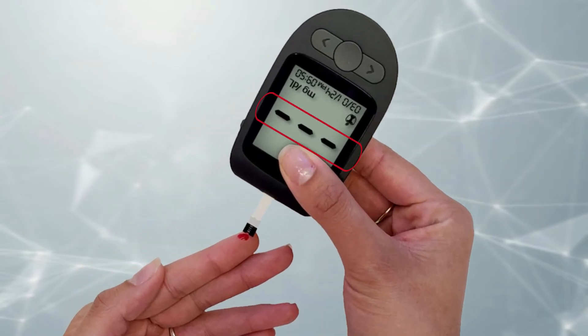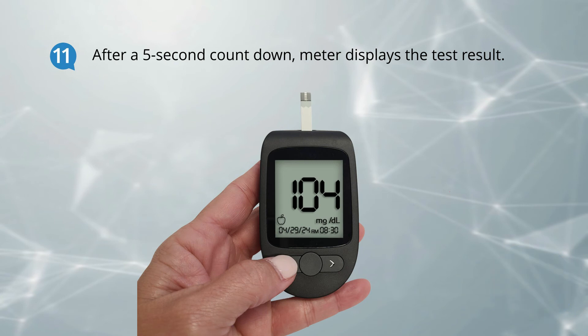Then touch the tip of the test strip to the blood drop and hold it there until the meter beeps. Dashes will appear across the display to indicate that the meter is testing. In five seconds, your blood glucose result is displayed in the meter.